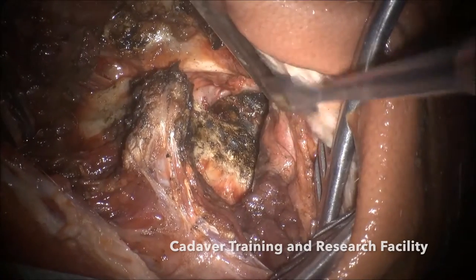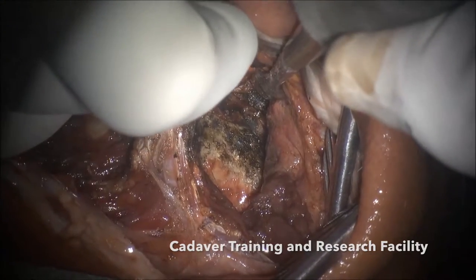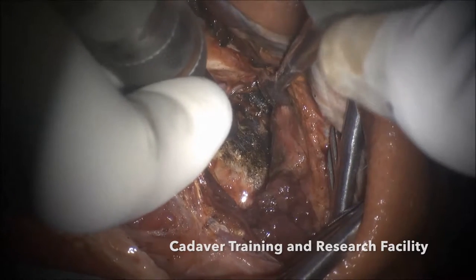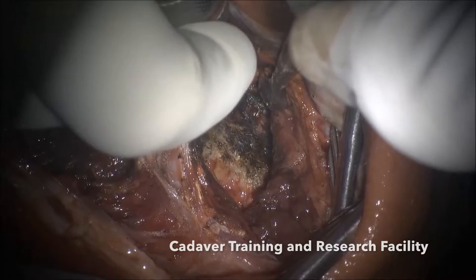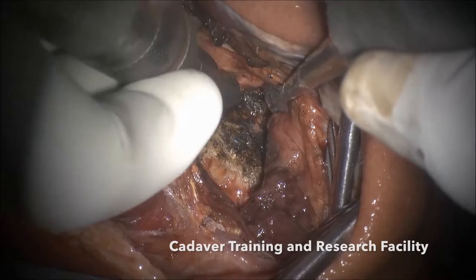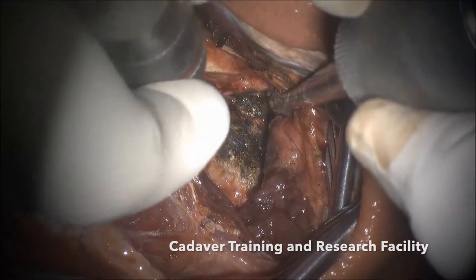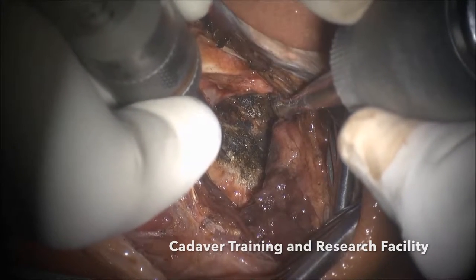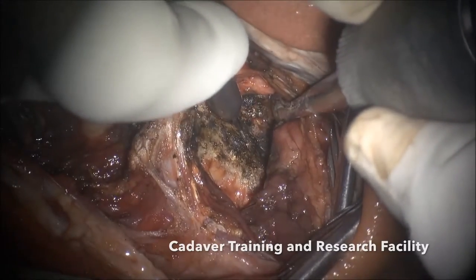Now I will show you how to put a screw in C1 and C2 — it is very straightforward. This is the middle part, this is the lateral part. This is where we start the traditional pedicle screw. This is where we put a sub-articular screw — I will not recommend a sub-articular screw because it is going to be very close to the joint and will make putting the spacer very difficult. I will not recommend putting it too low down because that increases the risk to the vertebral artery. So somewhere in between is the traditional point.